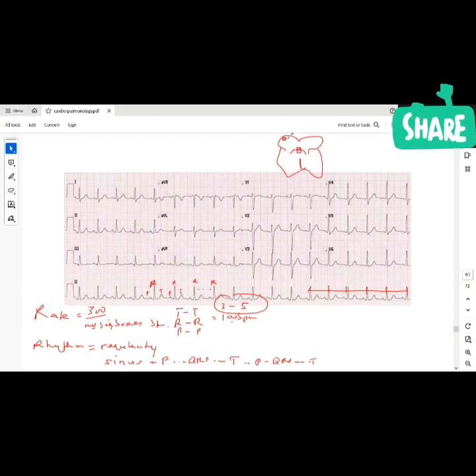If my beat starts in the SA node, what will be depolarized first? The atria become depolarized first, which will be the P wave. Then I have a pause in the AV node, and then I depolarize both ventricles simultaneously, and that will be my QRS. Then the ventricles undergo repolarization, which will be the T wave.